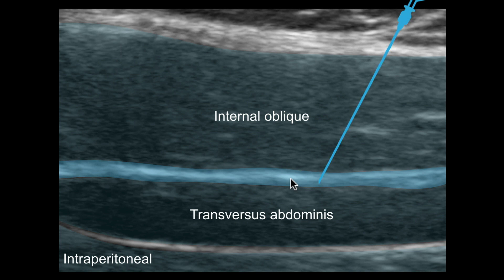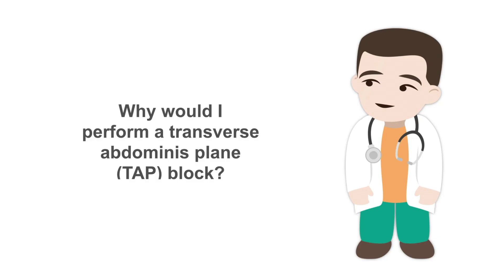I recommend doing this block in-plane, following your needle throughout its entire course. First, I always feel better when I can see the needle in view for the entirety of the procedure. Second, the peritoneum is very close by — you need to make sure you do not go deep enough to touch the peritoneum, or pierce through it into the critical structures we discussed.